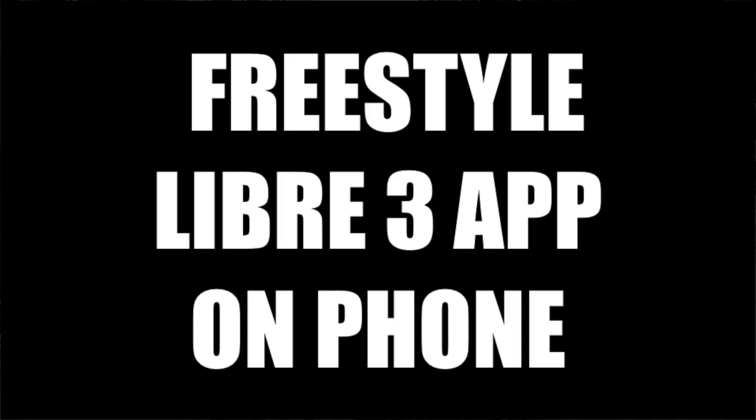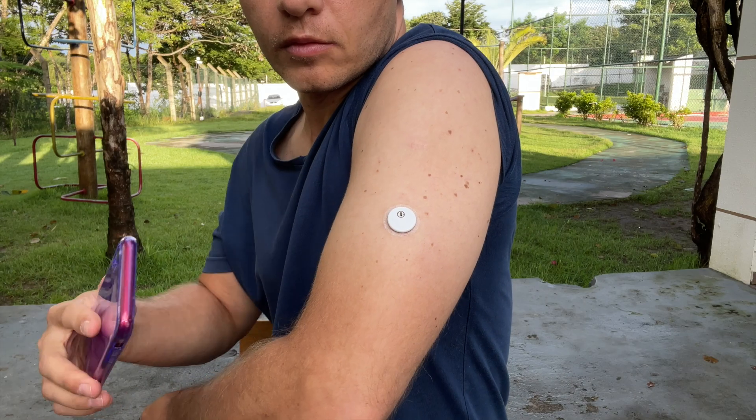If this is your first Libre 3 sensor, you need to go through two steps. Step one is setting up the Freestyle Libre 3 app on your phone, and step two is applying and activating the sensor.